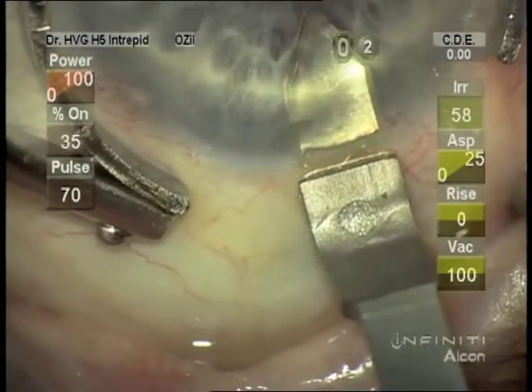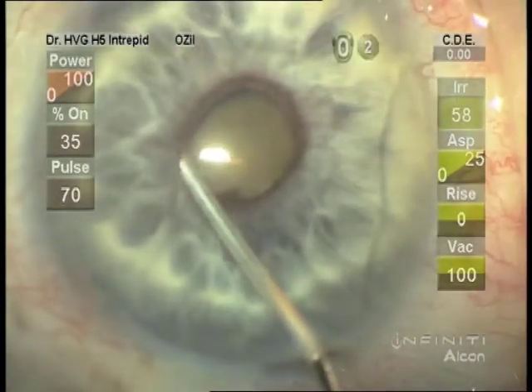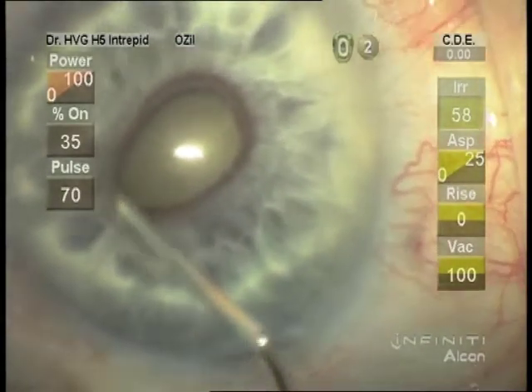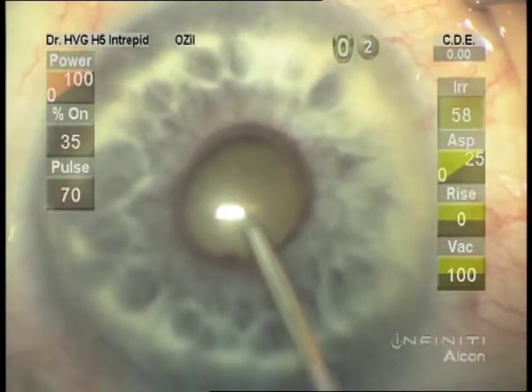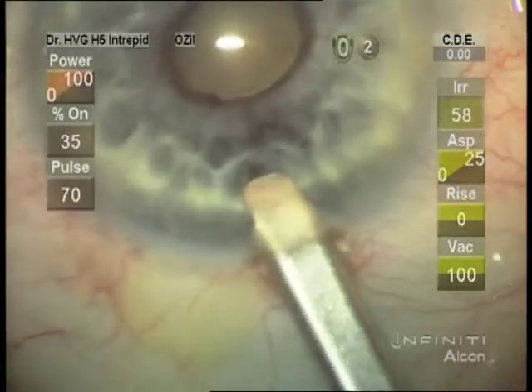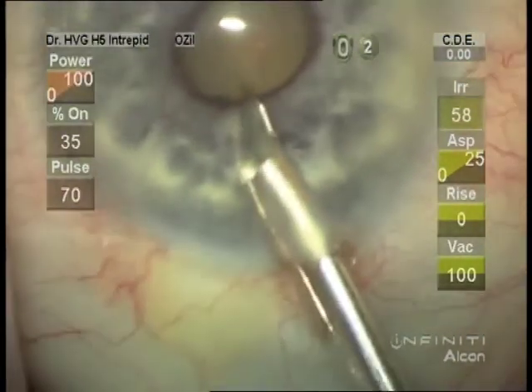To place the Malyugin ring we need to have some viscoelastic under the iris. After the main incision, we're breaking more synechia and adding more viscoelastic with visco dissection to give that space to be able to engage the edges of the pupil with the Malyugin ring as it enters the eye.